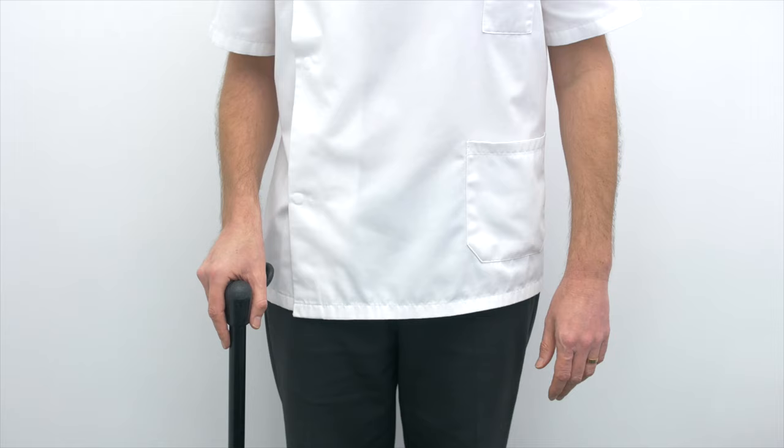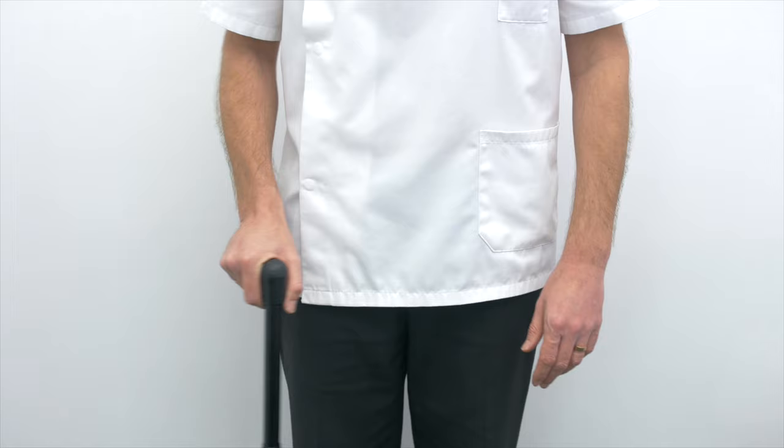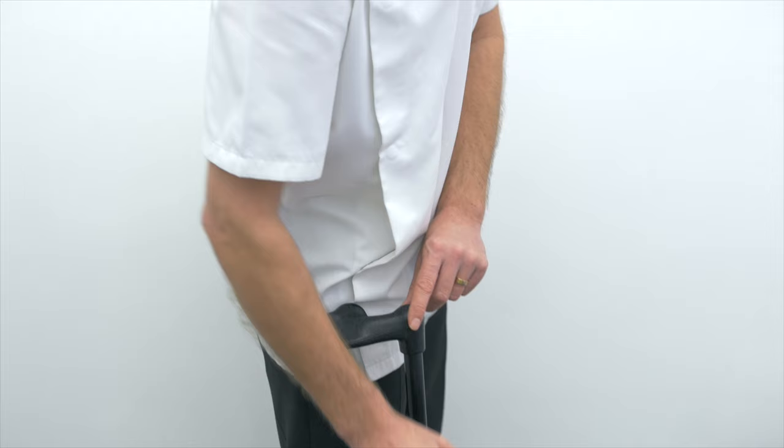Walking sticks — let's just clear up a few myths. What side do I hold my walking stick on and what's the correct length? A walking stick should allow your arm to bend at about 20 degrees. If it's too short you're going to be leaning too heavily, and if it's too long you're going to cause yourself shoulder problems.